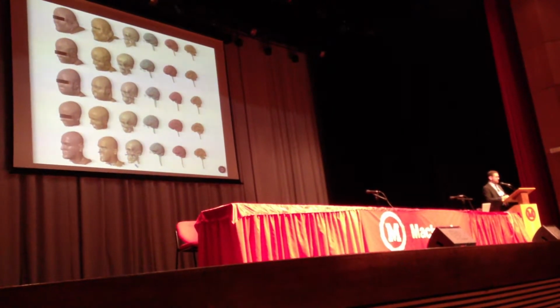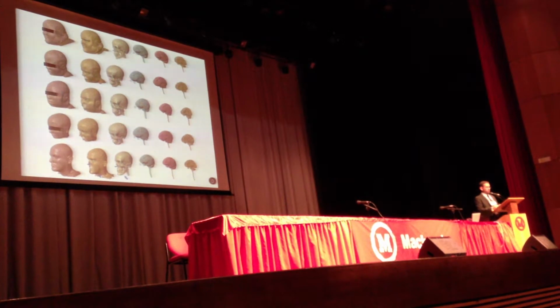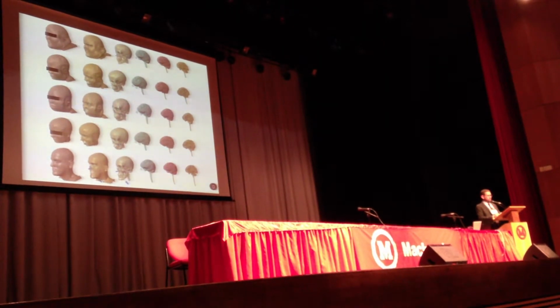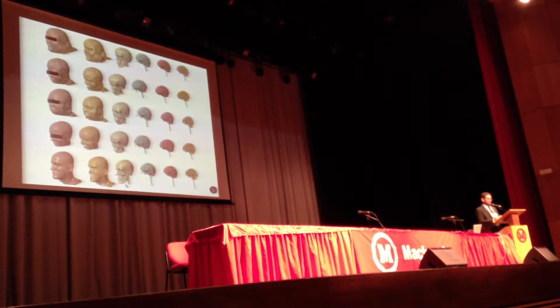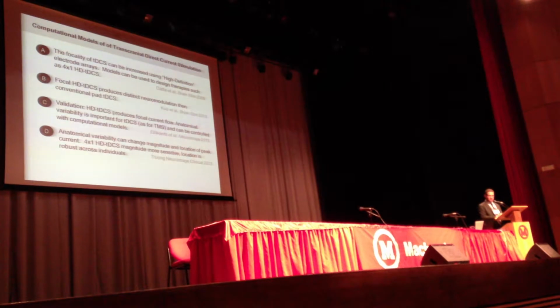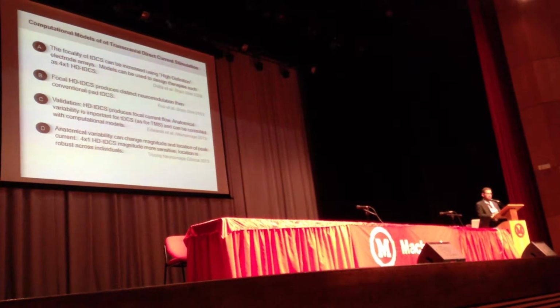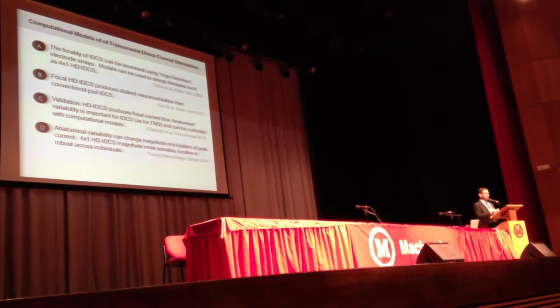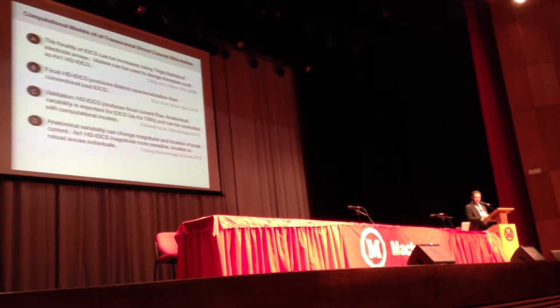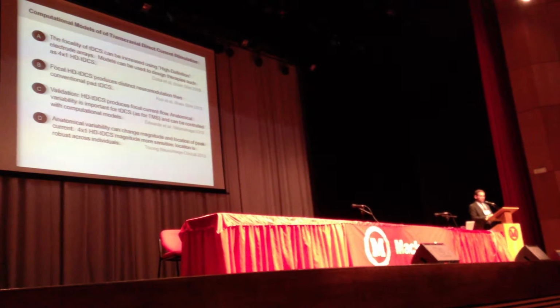And the bottom line is that people's heads are very different shaped, very different skull shape, very different level of fat. The brain morphology can vary significantly across subjects. And as a result of this, even when you apply the same outside dose to every subject, what's produced on the inside is not the same. And so I'll just, in the interest of time, jump to the main conclusion of this study. It reinforced what we found in the Edwards study of large differences across subjects, 2 to 3-fold just across healthy, typical adults. I'm not even talking about the presence of injury and so on. What's nice is that the models, we believe, can be used to predict these variations and make corrections for them.